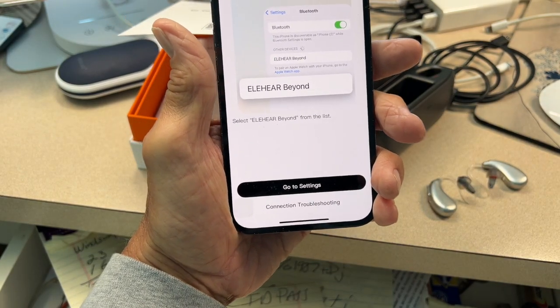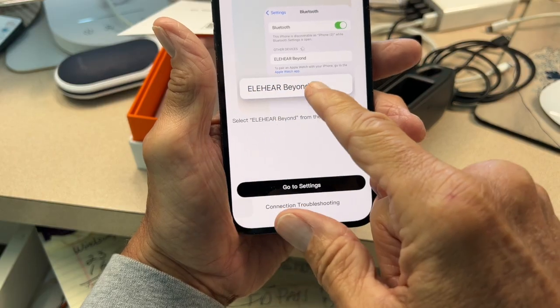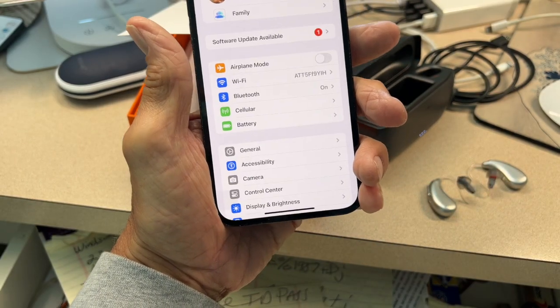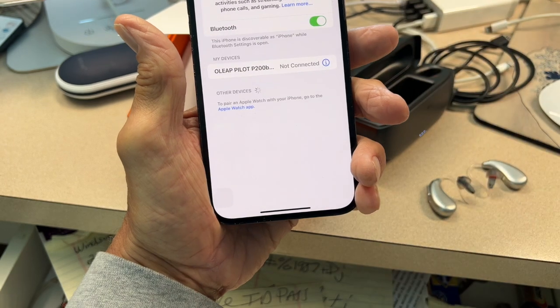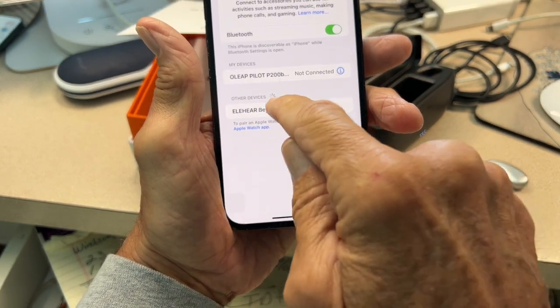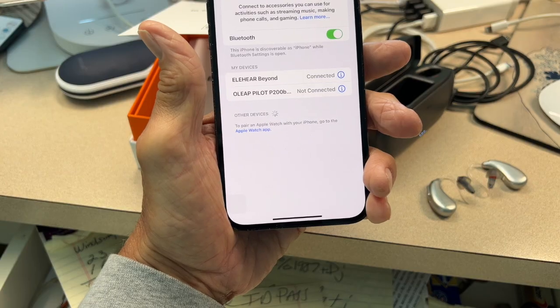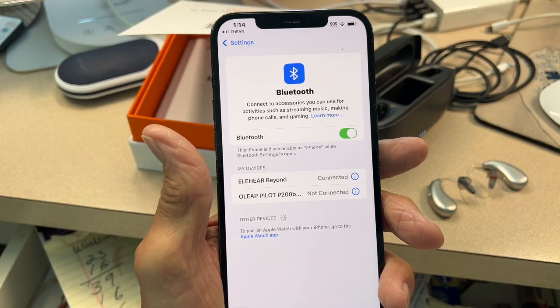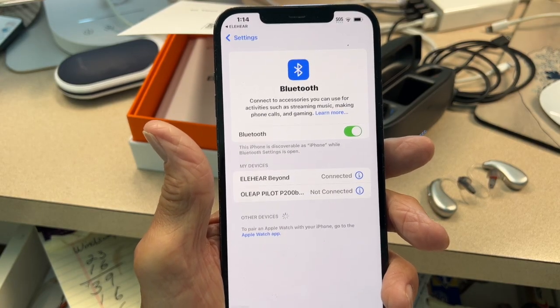All right, it says go to settings and Beyond, go to settings. All right, let's do that. All right, let's go to Bluetooth. There it is right there. Hit that. And bam, Bob's your uncle. We are now connected to our phone. All right, bam. We are connected to our Bluetooth.